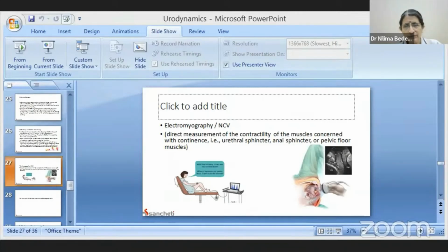So this is the normal bladder filling pressure. During the storage phase, the bladder pressure should be less than 15 centimeters of H2O. This pressure varies slightly between lying down, sitting and standing, but during the storage phase, it should not increase more than 15 centimeters in any position, unless there is a problem. The urethral closure pressure at a younger age is around 50 to 70 centimeters H2O.